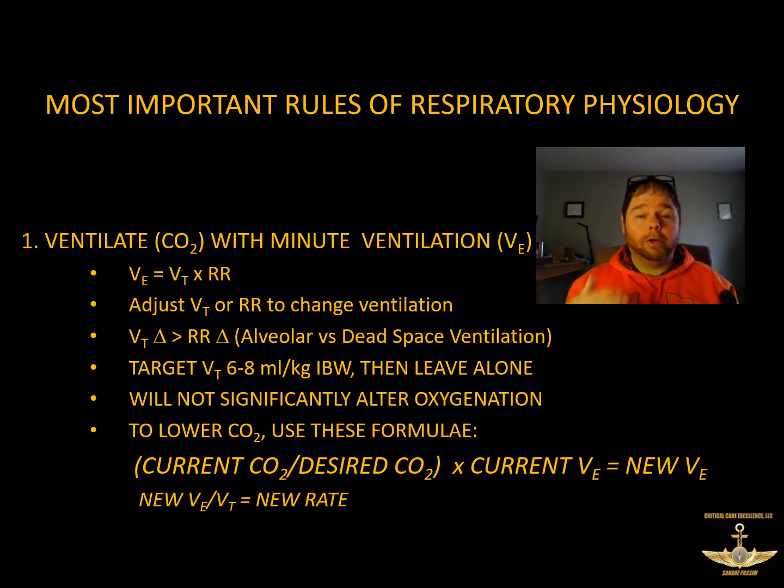But once you start correcting that problem, whatever you do to change minute ventilation is not going to help you oxygenate. So I've always said you can't ventilate your way out of an oxygenation problem, and that's true. So if you encounter a patient whose O2 sats are low, changing their rate or tidal volume is probably not going to help you. But it will help you move CO2, which is your goal.